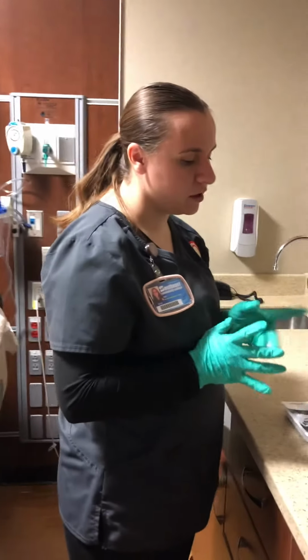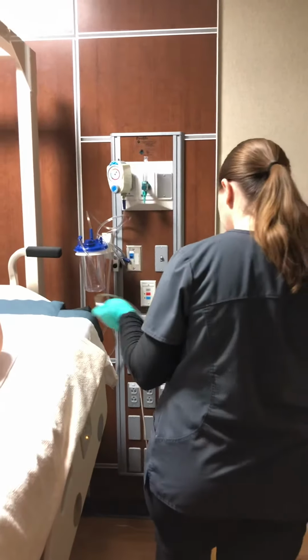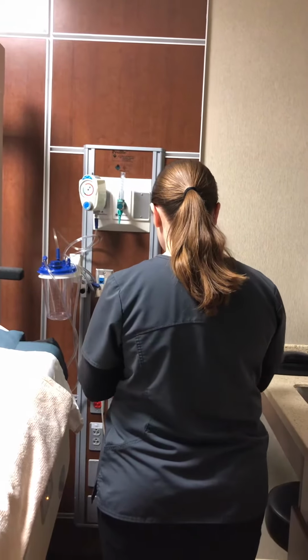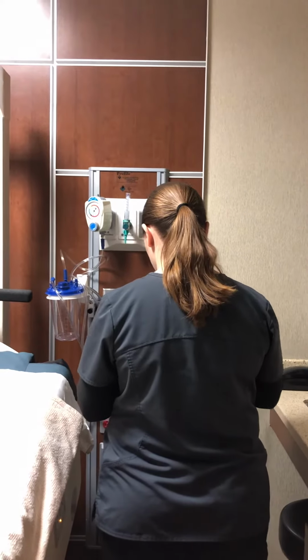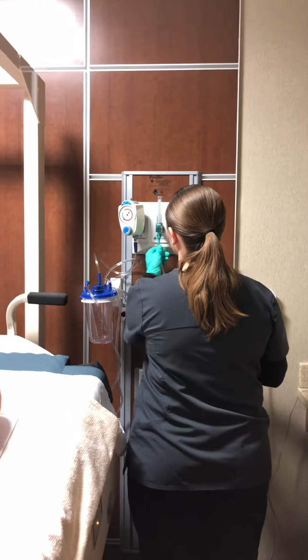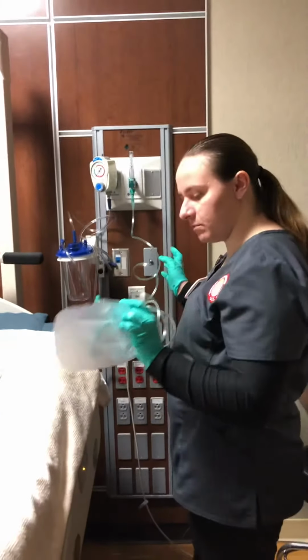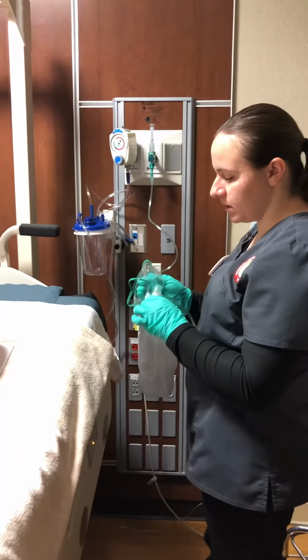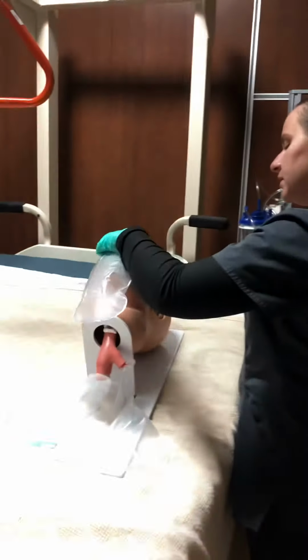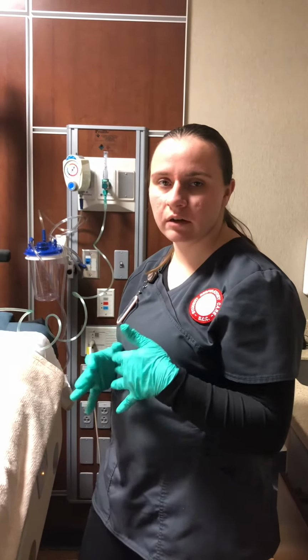So always you want to oxygenate the patient, so I'm going to go ahead and get their oxygen mask ready here. All right, so I'm going to connect it to here. And as always with these masks, you want to make sure the bag inflates before you place it onto the patient. So always when you go to suction a patient, you want to hyperinflate their lungs. That way you can easily get the secretions out of their lungs without any complications.